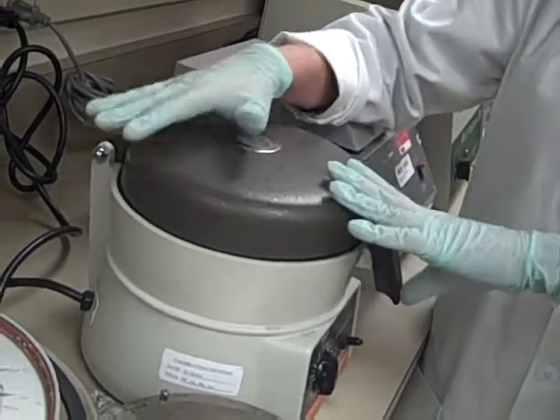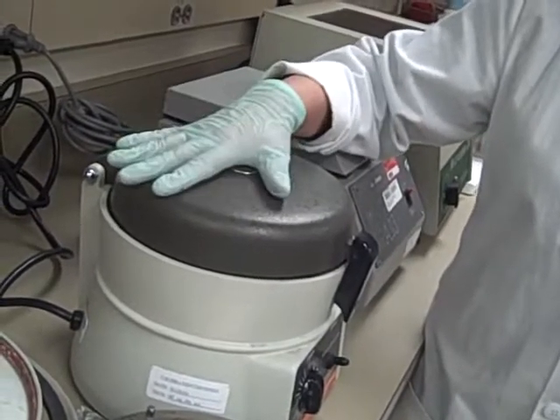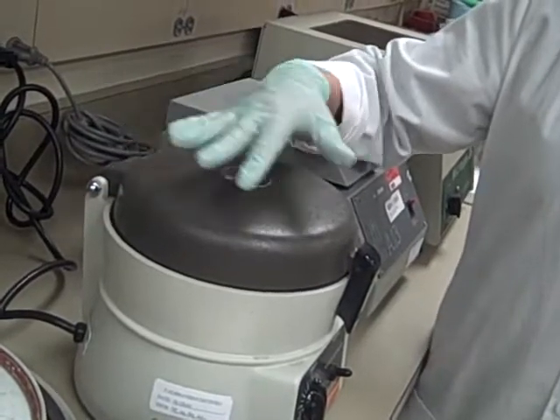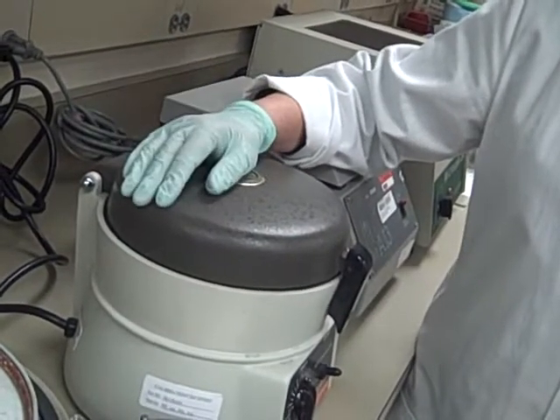Five minutes, and that's going to give us the maximum packing in the least amount of time. So what happens if we forgot about it or the timer didn't work and we came back and it was 10 minutes? Is that going to affect anything?